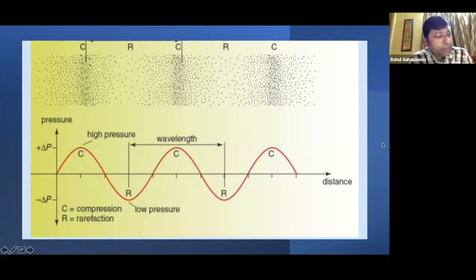The transmitted wavelength is important. Shorter the wavelength, higher is the image resolution and sharper the image. However, the wave can travel shorter distances and thus fail to penetrate deeper structures. Take home message: select the appropriate probe frequency to ensure adequate penetration to the tissue of interest while ensuring optimal image quality.